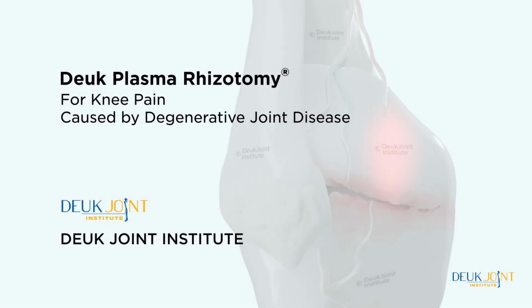Deuk plasma rhizotomy for knee pain caused by degenerative joint disease, only available at Deuk Joint Institute.